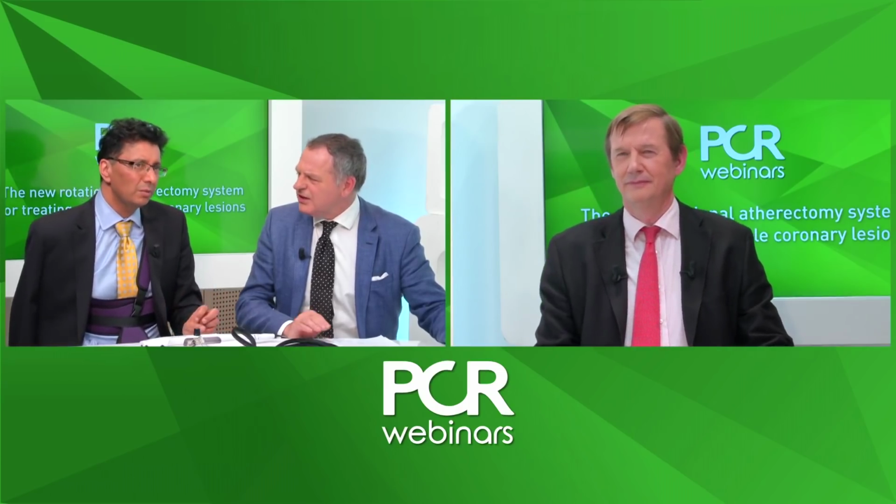I'd absolutely agree with that. I've got a little algorithm of things that I would do. One is a step down: if you're using a 1.25, you go to a 1.5... I mean, if you're using a 1.5, you go to a 1.25, absolutely. Guide support is next, and also checking the position of the wire, because if the wire is not deep enough in the vessel, you just don't get the purchase that you need with your forward pushes. Those are the steps that one takes. We have to absolutely adapt, and you've got to approach it systematically.